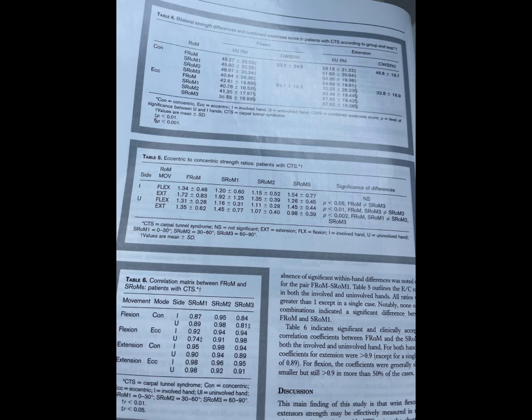When performing an isokinetic test of flexion and extension of the wrist, the fingers grip a handle that constitutes an integral part of the special wrist attachment provided by the manufacturer. Thus, instead of effecting a pure flexion extension pattern by placing the lever arm hand interface at the level of, for example, the metacarpal bones, the palm, this attachment mandates a firm grip of the handle, ostensibly to better stabilize the biomechanical axis alignment.